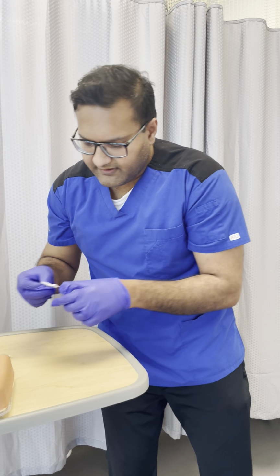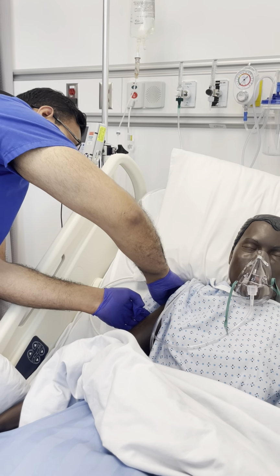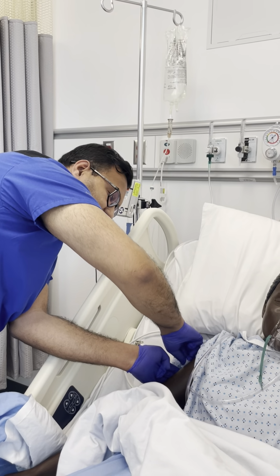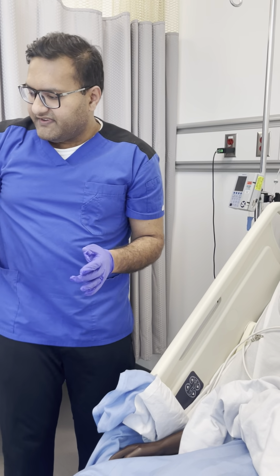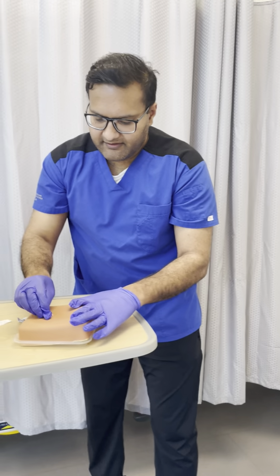So with that, I'm going to take an alcohol swab, and I'm going to swab for 15 seconds on the site and allow it to dry. Now, once the site is clear, I'm going to use this as a demonstration.